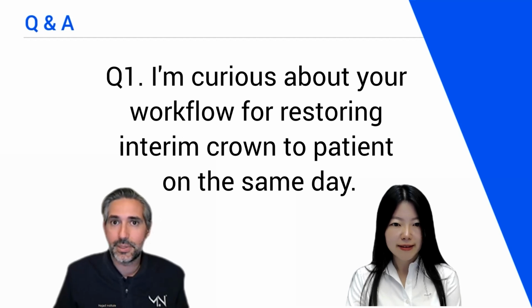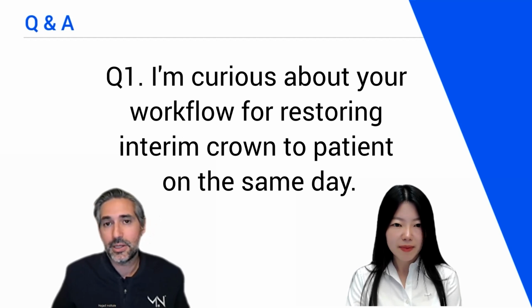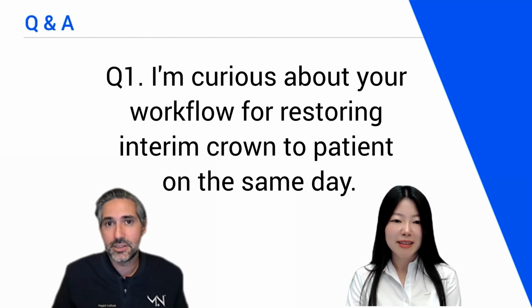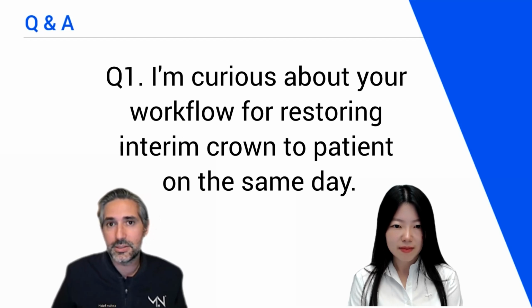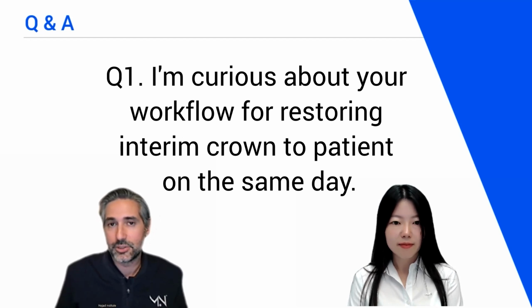That would be with PMMA, but I'm using the putty and bisacryl, which is the gun material that basically auto mixes. There's a few of them out there. My favorite one is Visalis from Kettenbach because it is a very strong material. I never really have problems with it fracturing, so that minimizes post-op visits for problems with the temporary. So that's what I usually use for a lot of these cases.